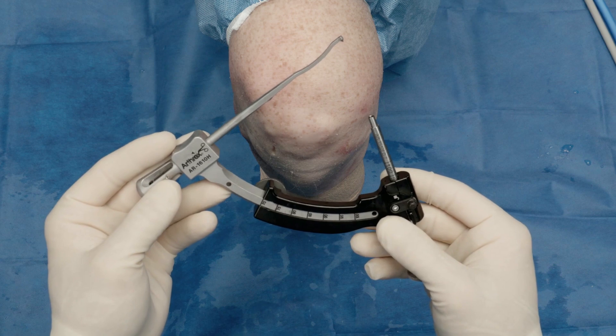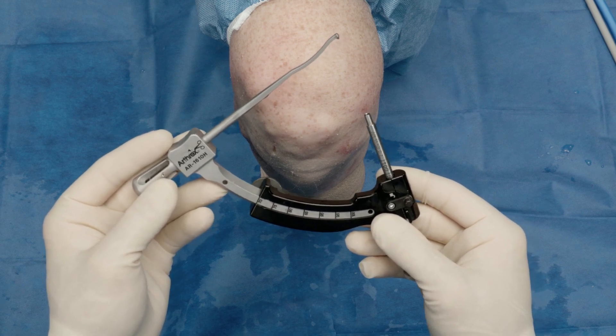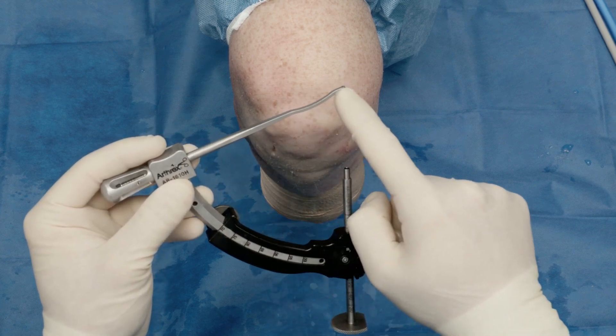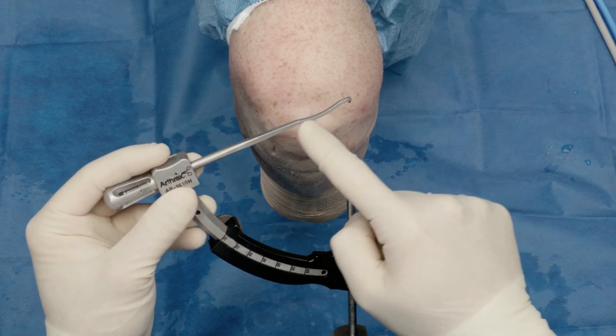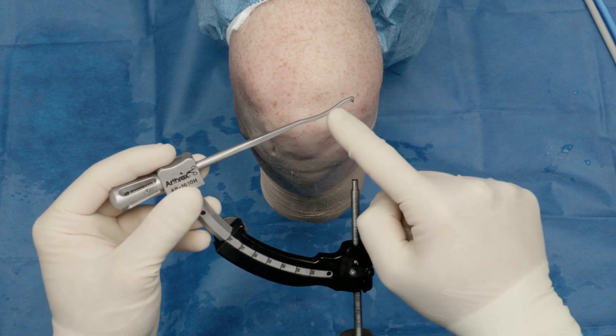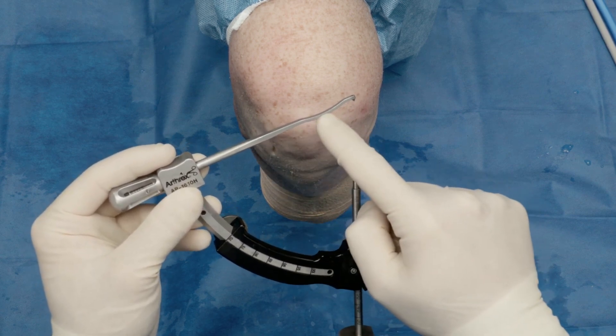There are a few features of this guide which really make the procedure more safe and more efficient. One is the shape — there's a cutout to go underneath the femoral condyle, so this is very low profile. It's designed to work in tight spaces.